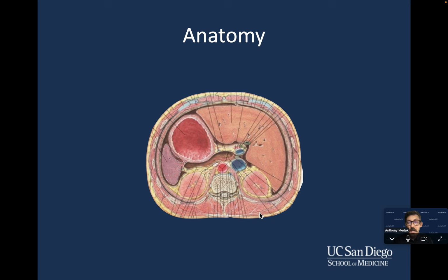If they're lying on their back, and for example, the patient has been stabbed, or the patient was in a motor vehicle accident and sustained a crush injury to the liver, and there's blood, that blood is going to trickle down and eventually end up in a couple of different places. One is in that splenorenal space right here, and the other place where that fluid might accumulate is right here between the liver and the kidney. So those are two particular dependent places where we're going to look with ultrasound, in the so-called hepatorenal and splenorenal spaces.